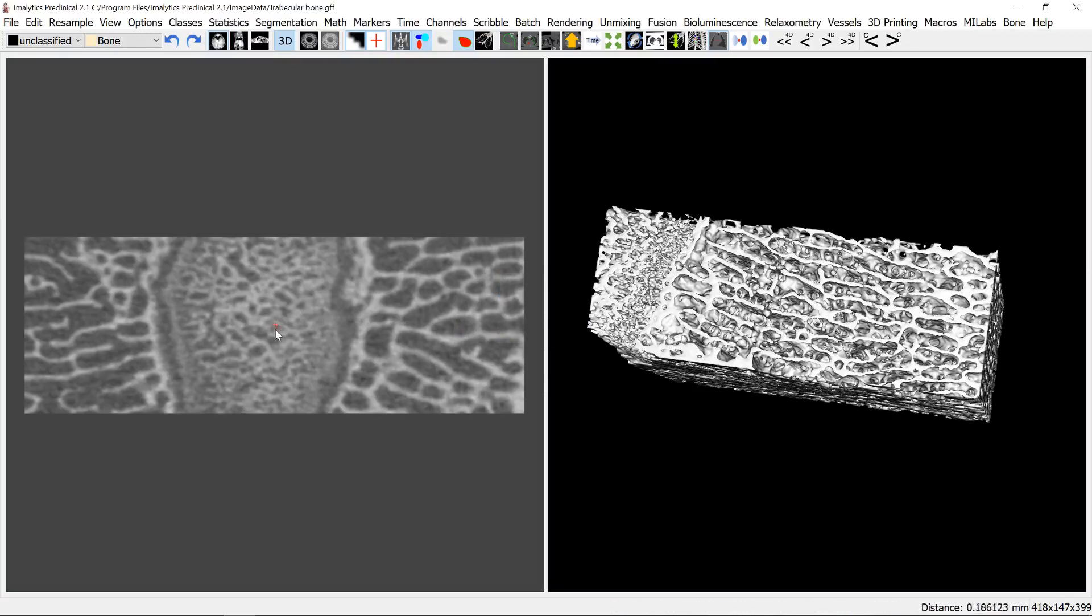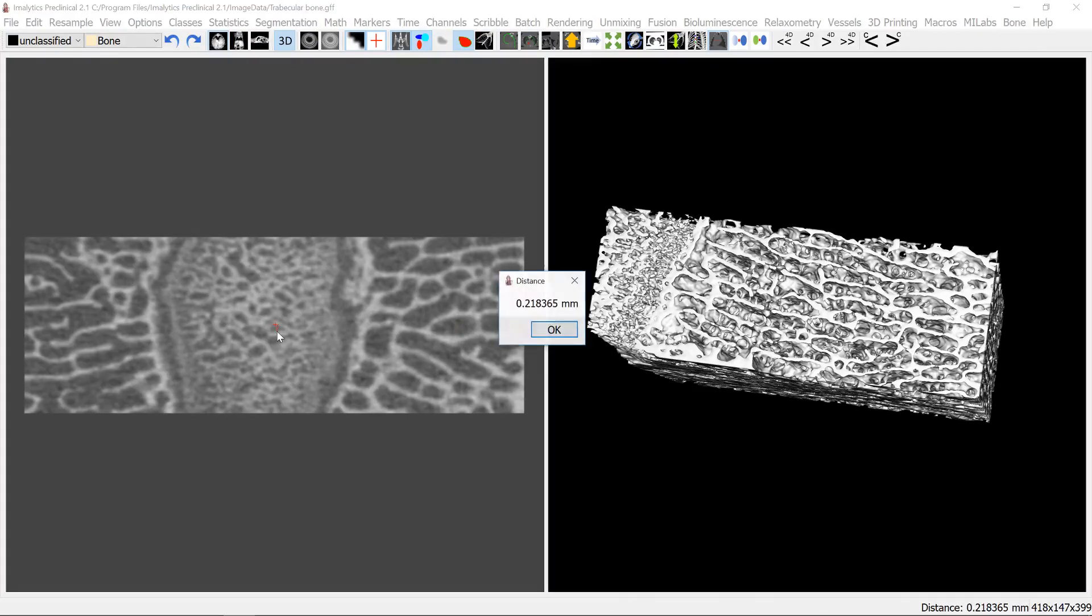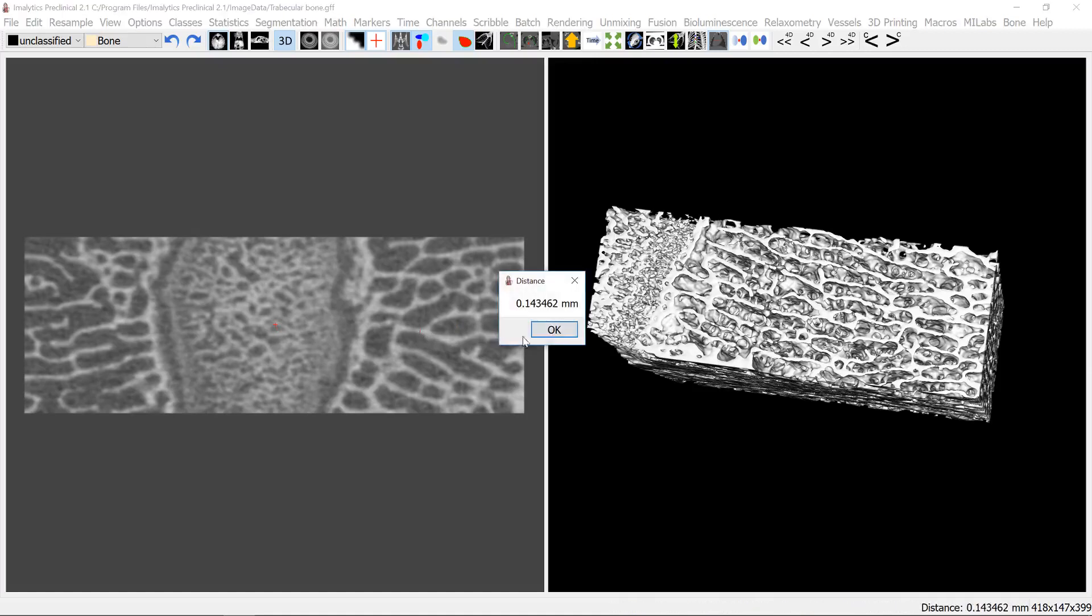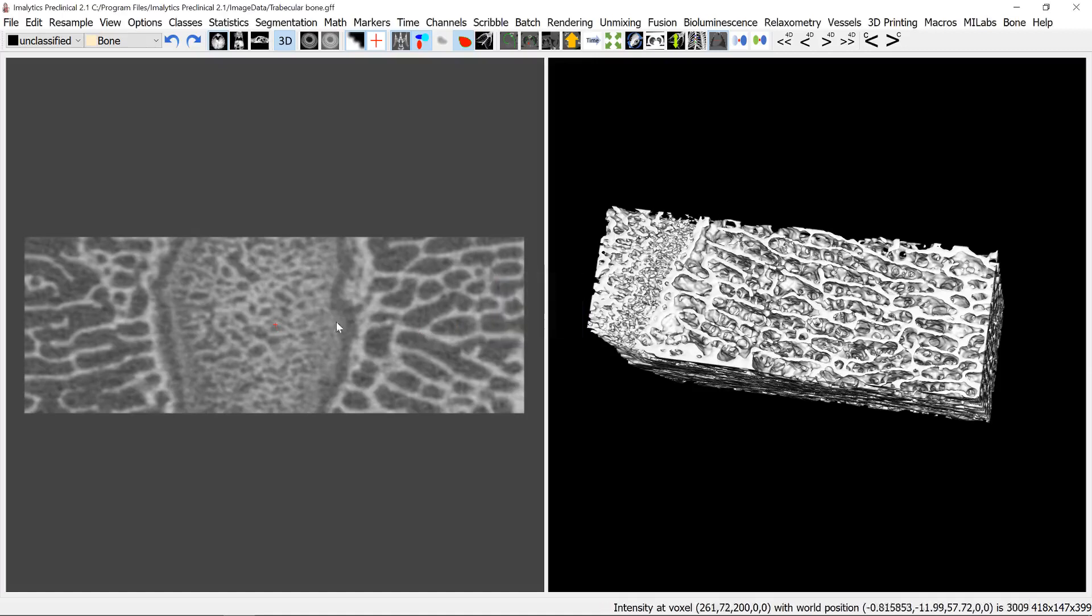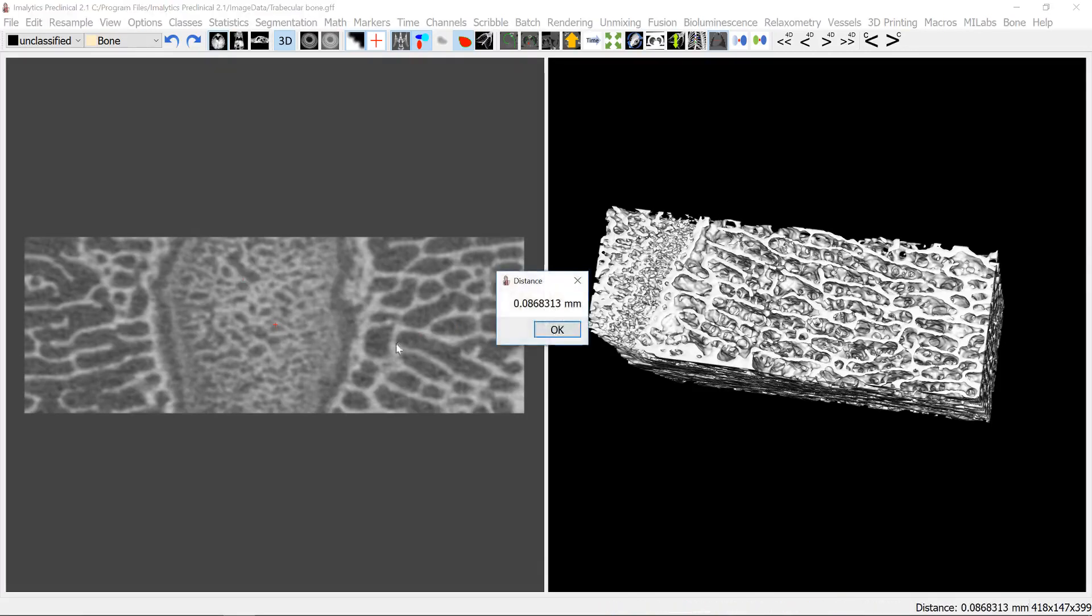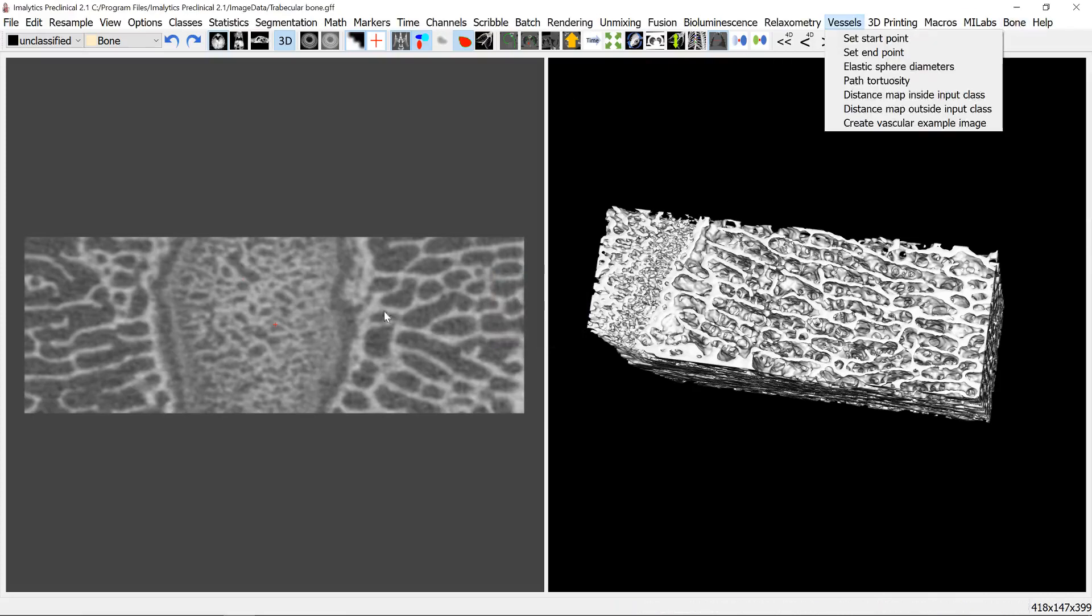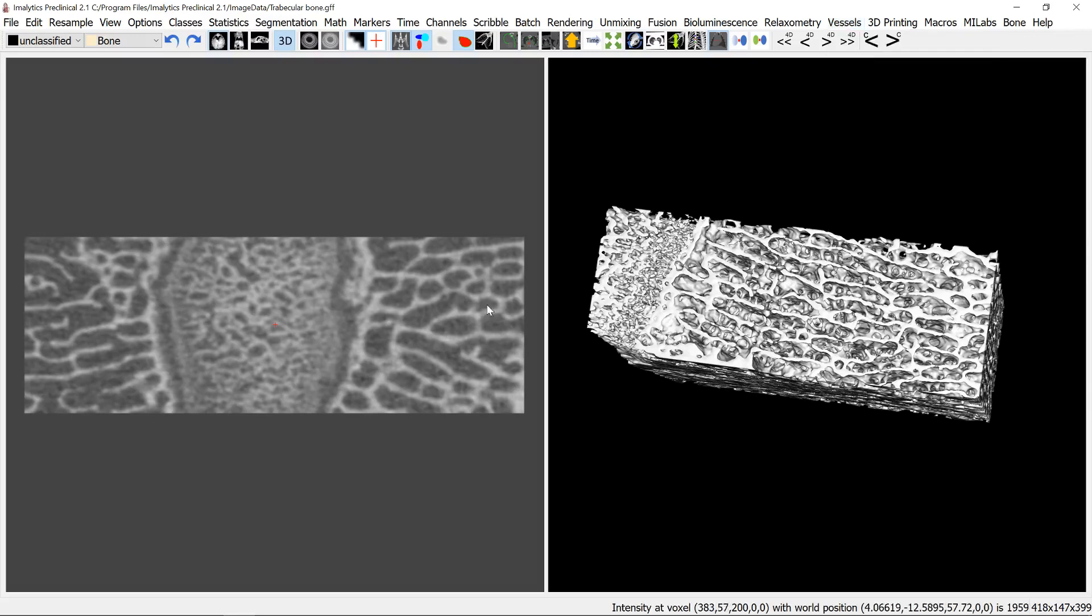And here the spacing, that's what it's called, is much lower in the middle. And on the other hand you can measure the trabecular thickness here and maybe here. And so with this bone module here you can measure these structures, the trabecular spacing and the trabecular thickness.